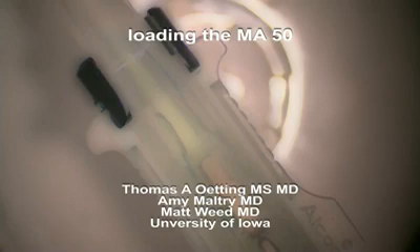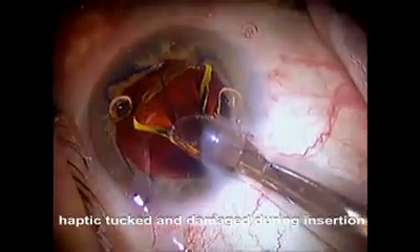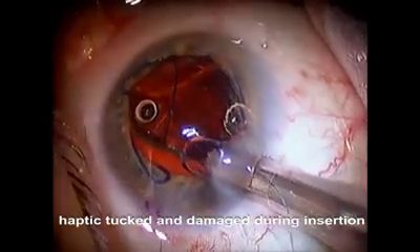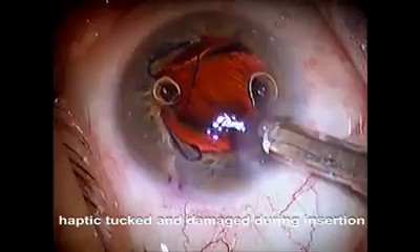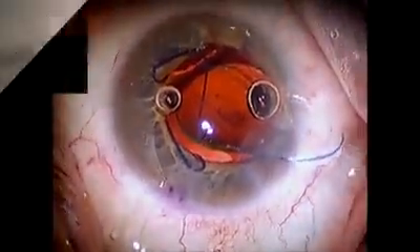Hi, this is Tom Oden from the University of Iowa. I'm going to show you how to fold the MA50 lens. Here you can see a three-piece acrylic lens which is coming in, and you can see that the haptic which had been tucked into the TACO formed by the optic has been damaged. So this is an example of how not to fold the lens.